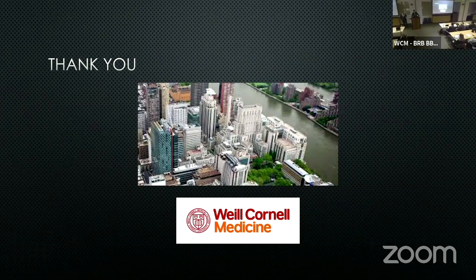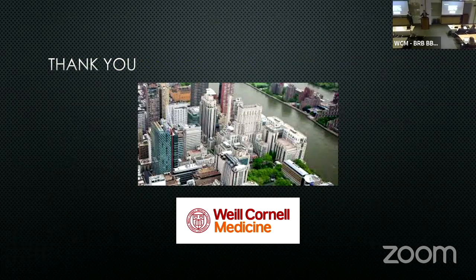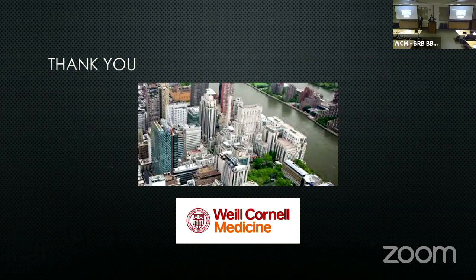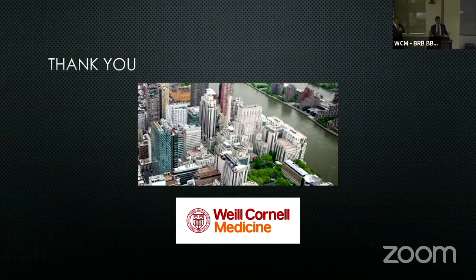Yeah, I think everyone has a different tolerance for how far they want to work away from the array, and it totally depends on if you're doing a previous instrumented fusion where you're just extending above and the anatomy is totally fused, right? A patient is L2 to 5 and you're just extending them above and below. That's going to be a very solid anatomy. Whereas if you have a patient that's de novo, they're young, it's tumor, they're going to be moving a lot. I tend to start up high and work toward the array. There are simple concepts I think that are important to practice, but we keep going farther and farther away, working farther and farther away to try to find what that accuracy is.